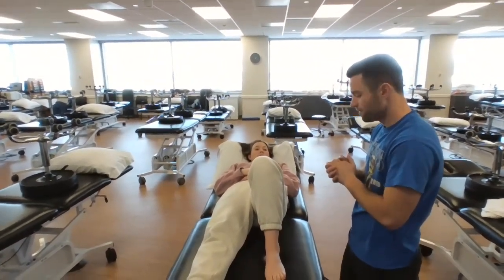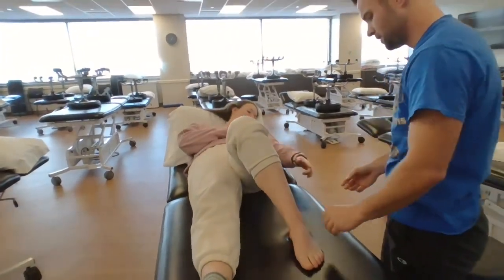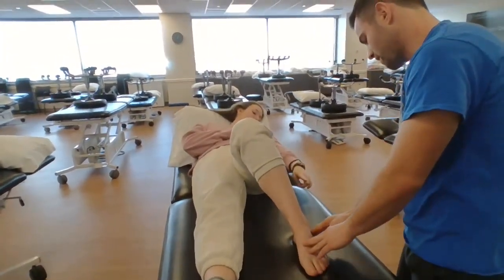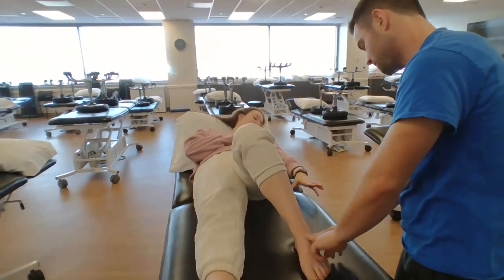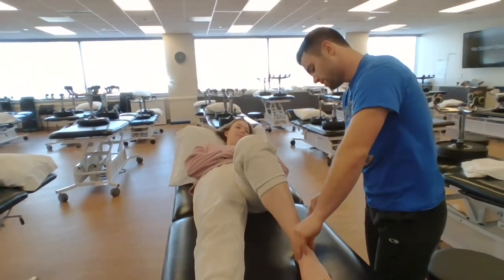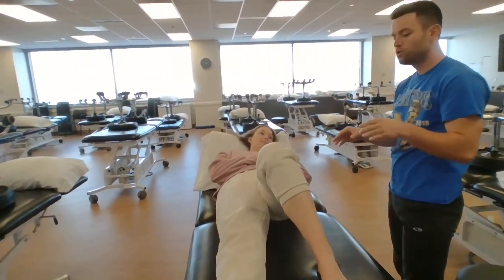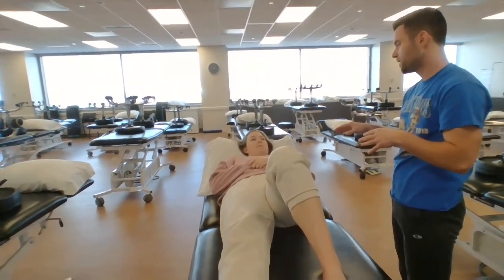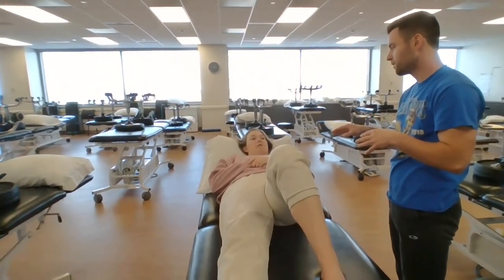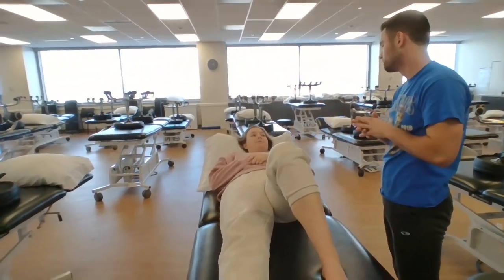Okay? Great. Can you tell me where your pain is on your ankle? It's on the outside. Outside, like right here? Yeah. Is there any on top? A little bit. Okay, great. So this treatment that we're going to do, it's going to be about 8 minutes. Are you comfortable in this position that you're in right now? Okay. If you get uncomfortable, tell me. We can stop, we can move around, we can change, okay?